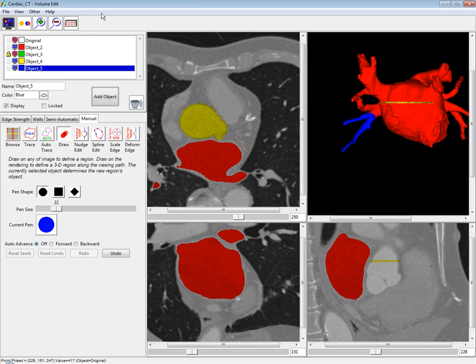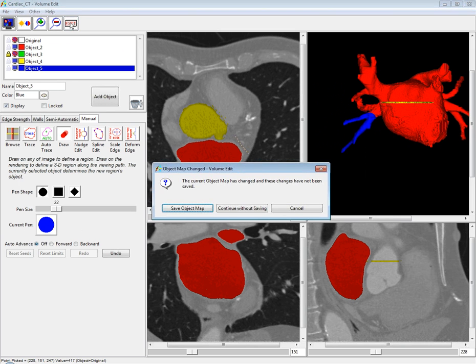That concludes what I'll be showing you in Volume Edit today. Again, there are additional new features here, so I'd encourage you to go to the website and take a look at that detailed document.